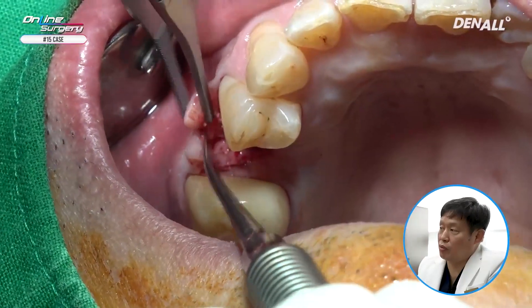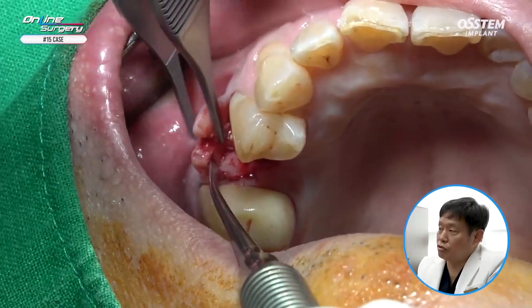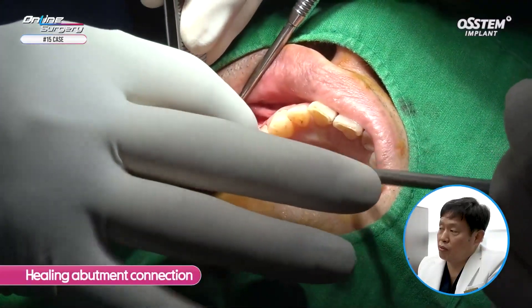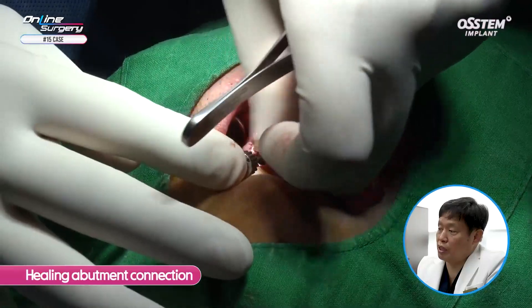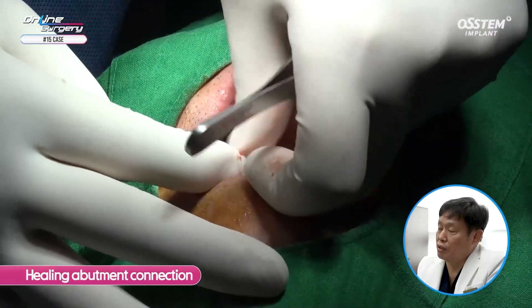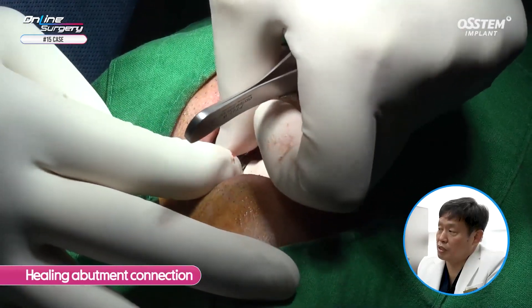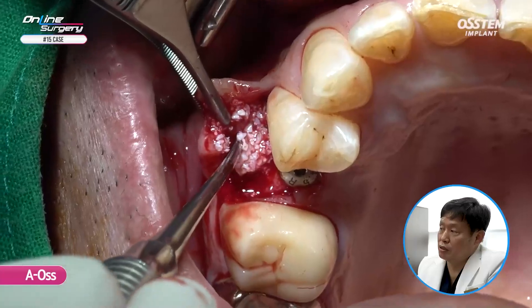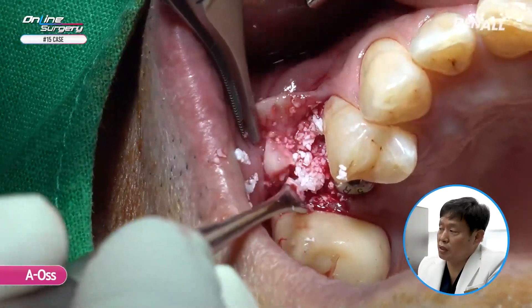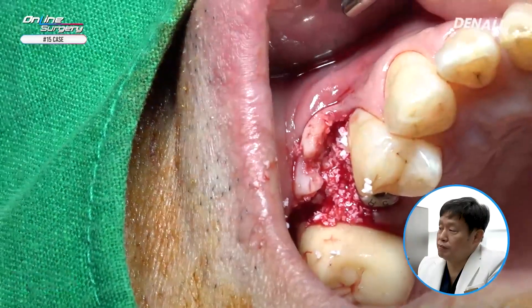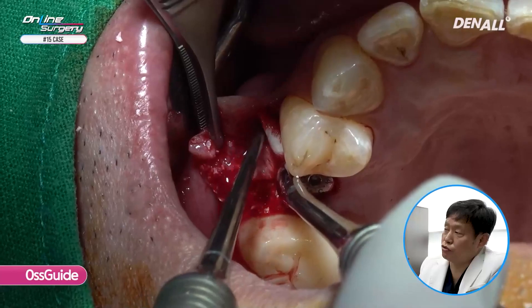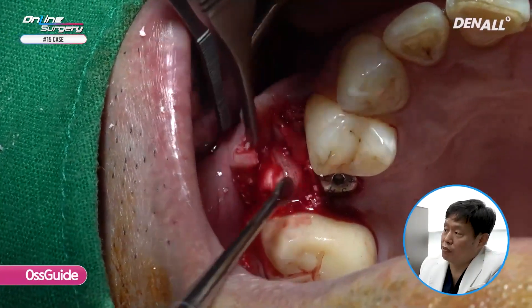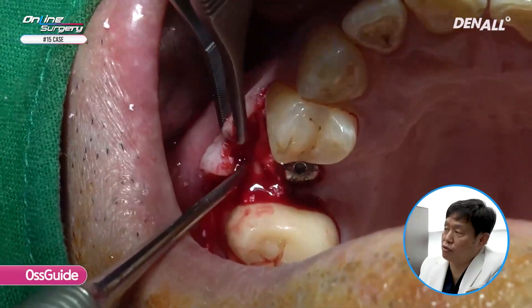Because this is an area where socket preservation was done, in order to maintain the buccal wall, you need to sufficiently graft A-OS. Therefore, on the buccal side, the flap was slightly elevated. Before doing bone graft, I'm connecting the healing abutment, making sure that the graft material does not go to the inner surface. On the buccal side, I'm using a sufficient amount of A-OS for bone graft. Because we want to ensure the buccal wall is maintained, OsGuide membrane is used and the membrane is covered. On the buccal side, additional bone graft was done.